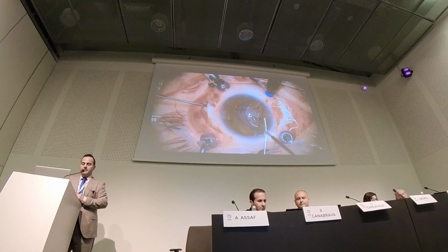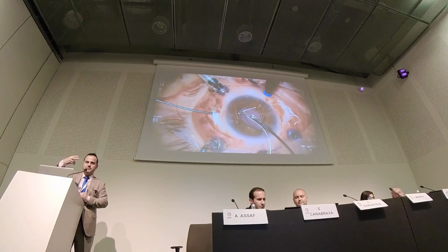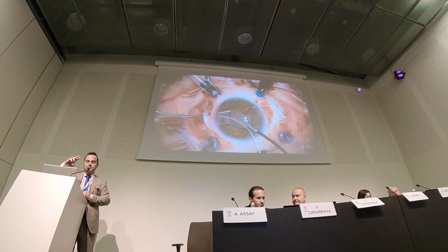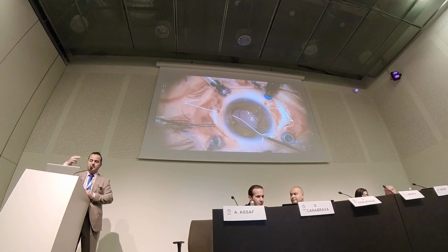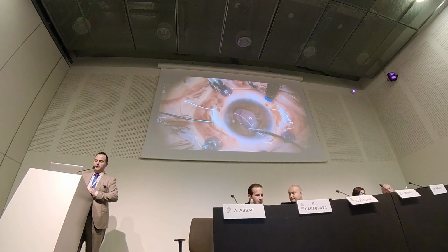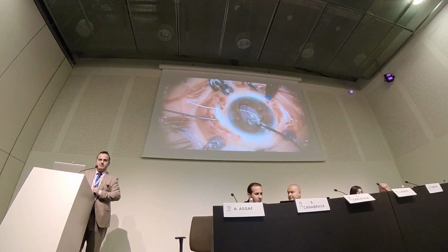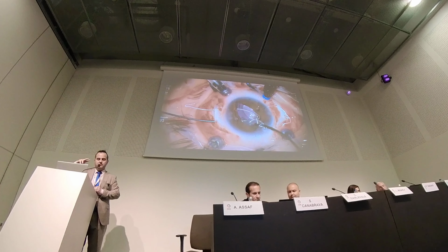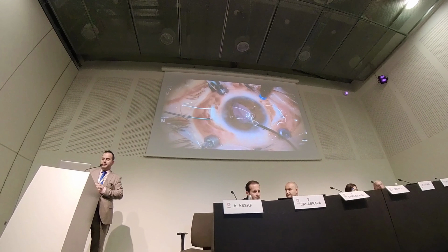And have in mind that the action of the jaws should be vertical, not horizontal. There are certain instruments which are microforceps but with horizontal action, and it is not convenient because you need to twist your hand in order to engage the suture. In my personal opinion, most of the maneuvers in the anterior chamber are done with vertical jaws, not horizontal ones. So just have it in mind.